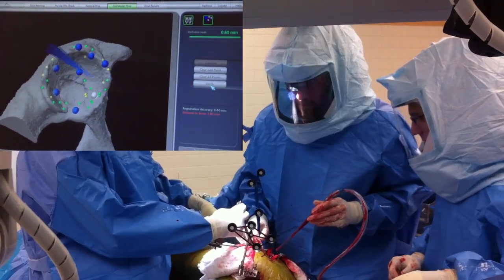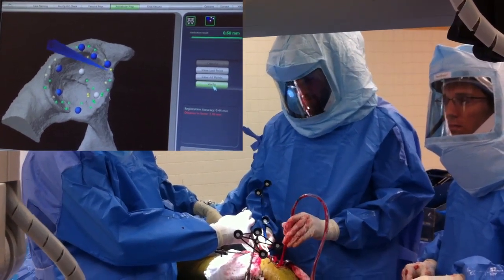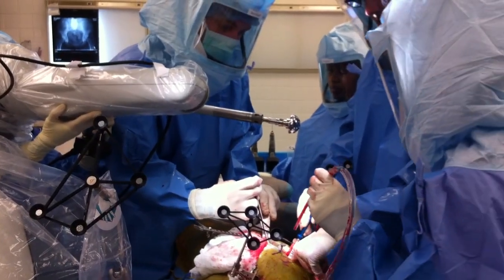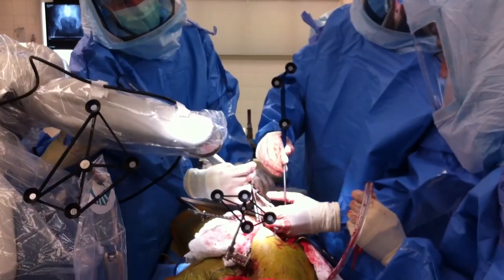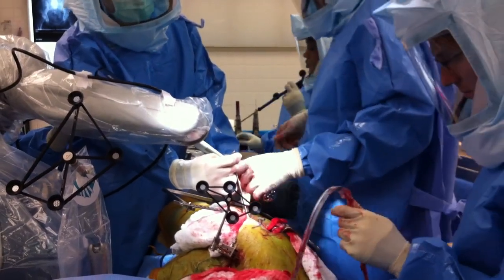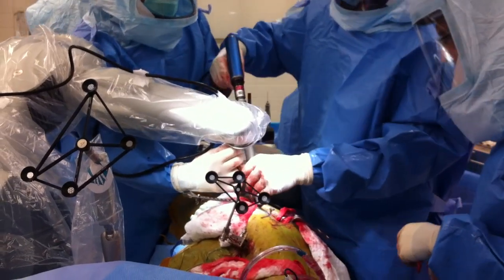This is a virtual model within the computer, and you can see in real time the probe registering on the virtual model. We then use the robotic arm to perform the reaming to place the cup. All of our bony work at this point, and all of our placement of the components for the hip replacement, is done with the robotic arm.